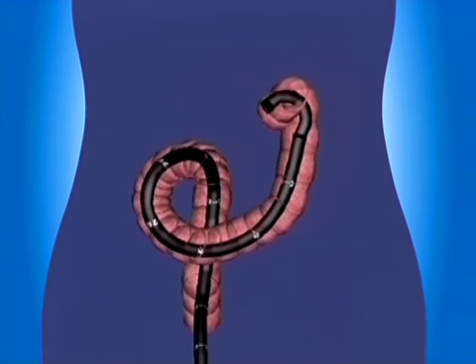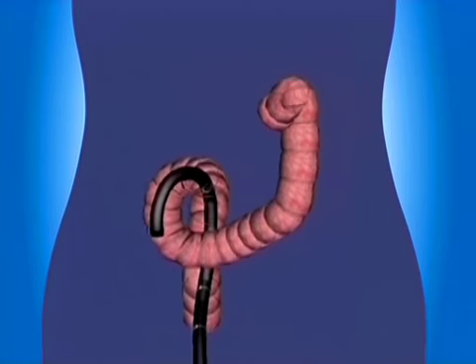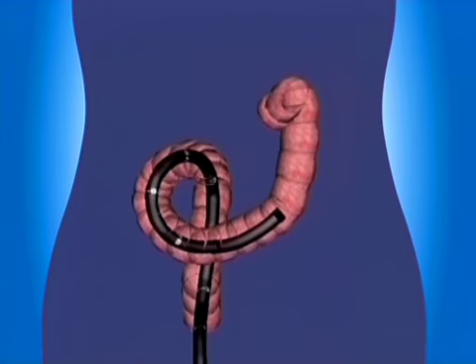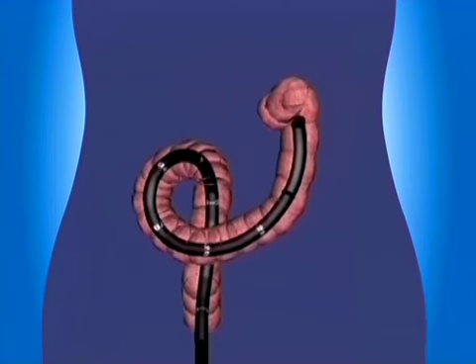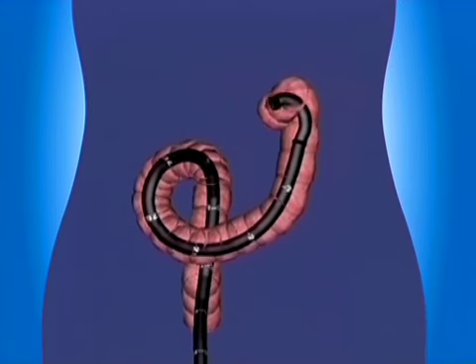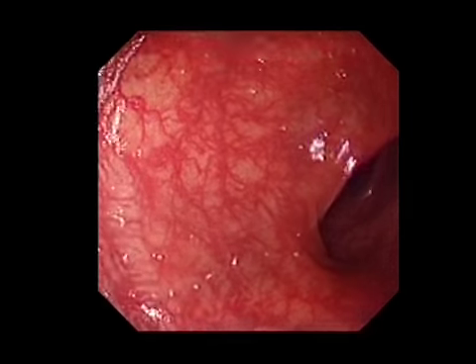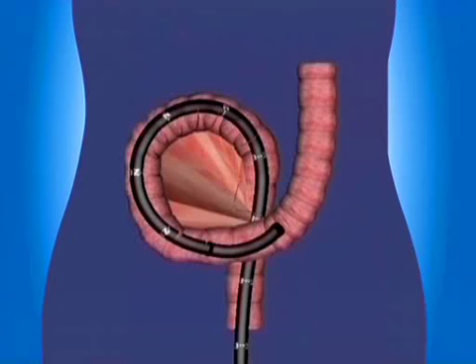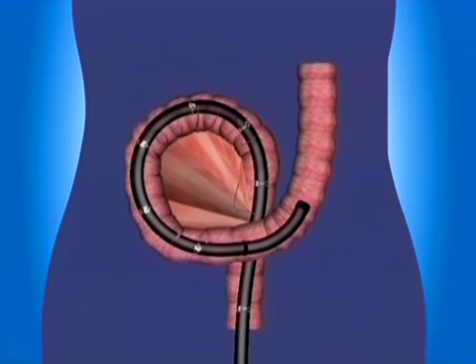But another loop, endoscopically very advantageous, is the alpha loop. The alpha is effectively a volvulus produced by the colonoscope when the sigmoid is fairly long and mobile, but the descending is retroperitoneal, so forming a fixed tunnel up the lateral wall of the abdominal cavity. So, if the scope seems to be running in fairly easily, without any very acute bends and not much discomfort, an alpha loop may be forming, and the correct thing is to go on pushing.